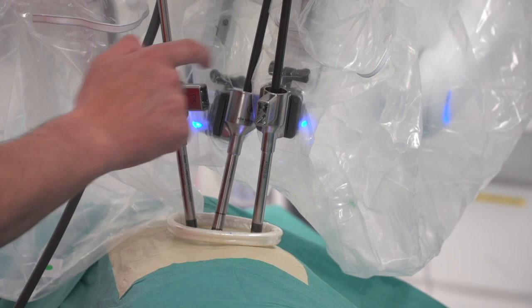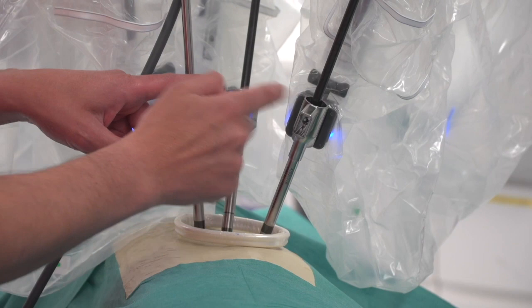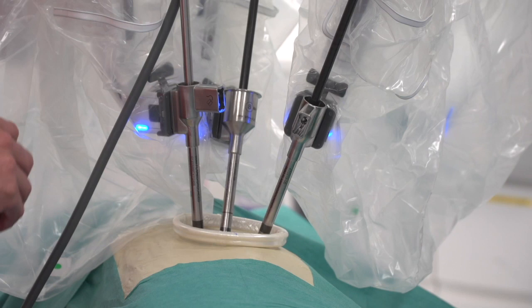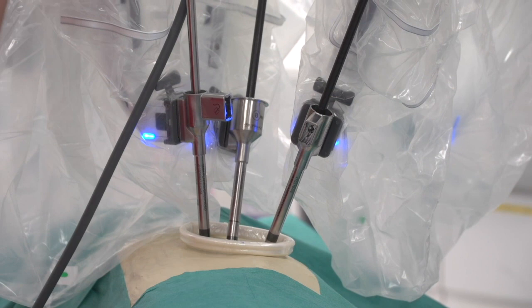I have three trocars like this, more space to work. You cannot put these together because they will crash. So you have to put them on the extreme, on the opposite side, upper and lower, and in the middle, in the center, you use this conventional tool. By doing this, we can approach upper, lower, posterior, anterior without any problem.